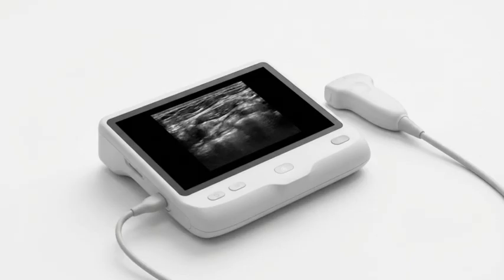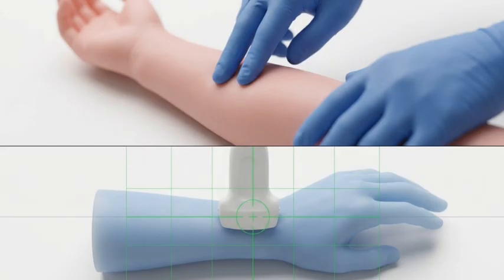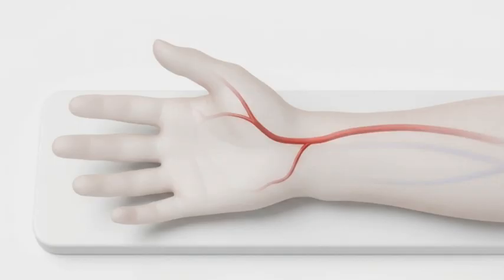That leads directly to step 3, image. Modern clinical practice relies on ultrasound guidance to look beneath the surface and confirm exactly what your hands are resting over. Replacing blind physical palpation with structured real-time imaging eliminates the guesswork. It is the definitive standard for preventing insertion errors. Let's apply this protocol, starting with arterial lines.